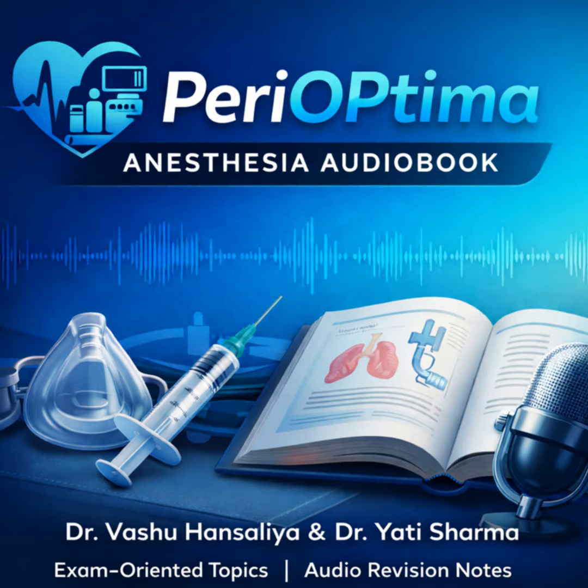And a quick note on pediatrics. AFOI seems like a non-starter there. That's correct. AFOI is generally not a viable primary option in children. Lack of cooperation, ethical issues. So what's the preferred method? Pediatric anesthetists typically prefer an inhalation induction with something like sevoflurane. You ensure spontaneous ventilation is maintained throughout, then you use the scope once they're deep enough. The principle of maintaining SVA is constant, even if the technique is different.